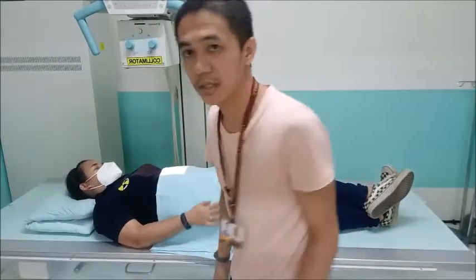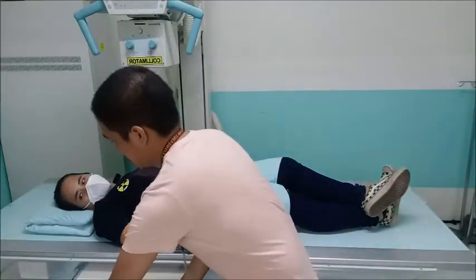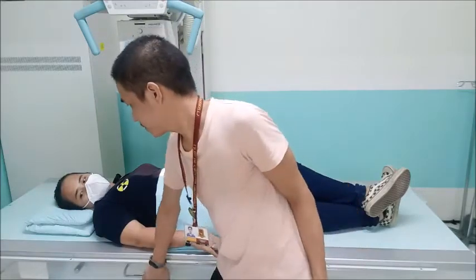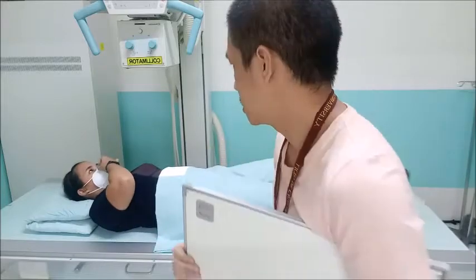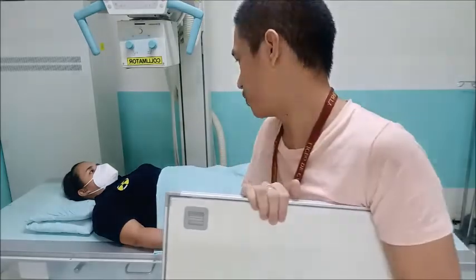Okay. Next, for the chest examination, if the patient has been confirmed with pleural effusion, that means there is fluid in the lungs. Sometimes the radiologist or the attending physician would require a decubitus positioning for patients with pleural effusion.